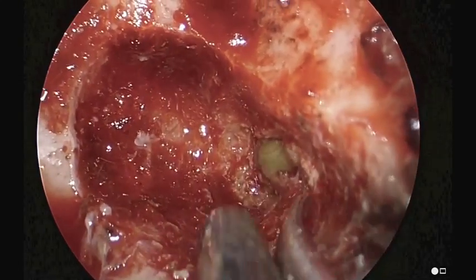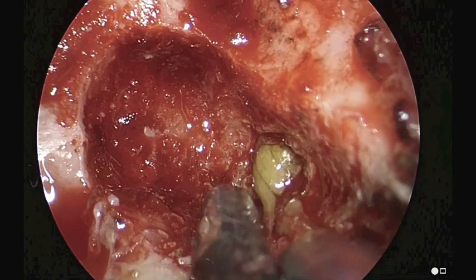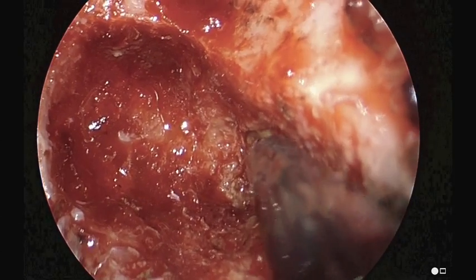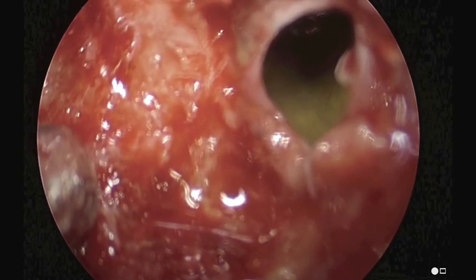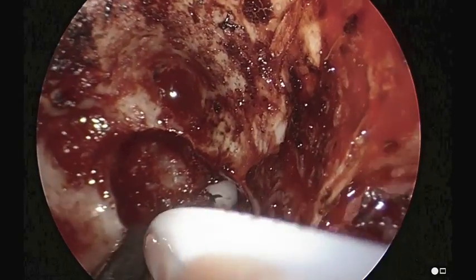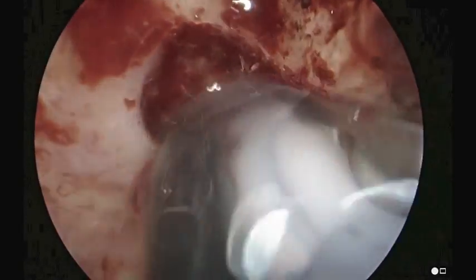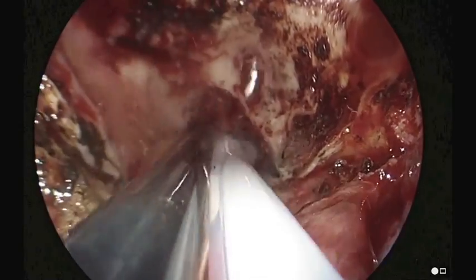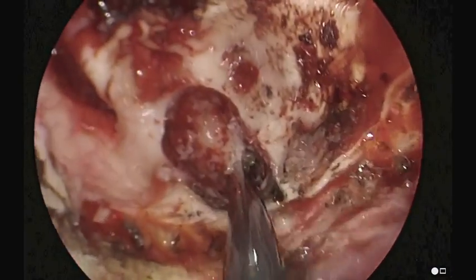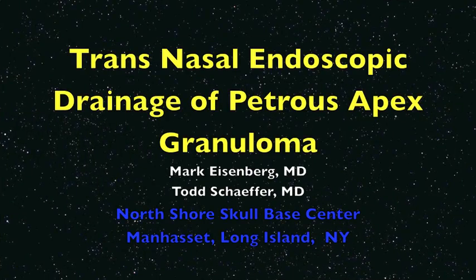At this point we're going to irrigate it. We place a catheter into the petrous apex and flush and irrigate out with saline. We can see there's still some thick viscous fluid that needs to come out. Once this is completed, we want to maintain this opening postoperatively by follow-up visits to maintain its patency.